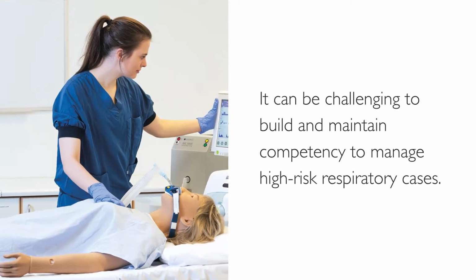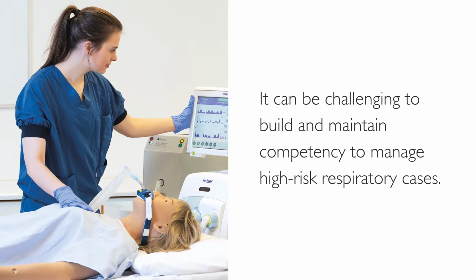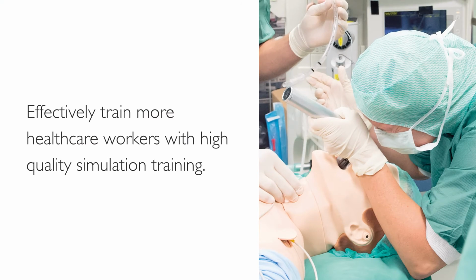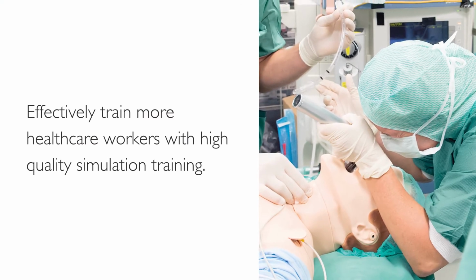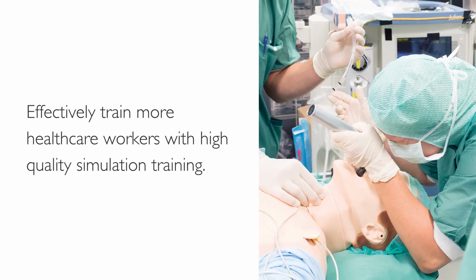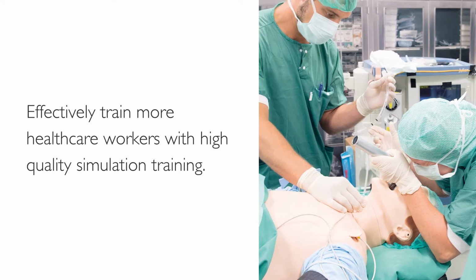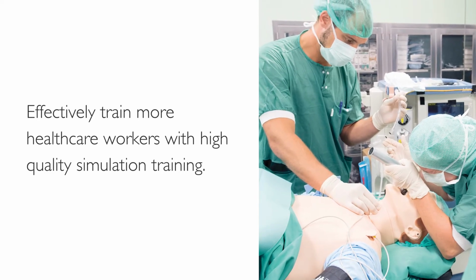Encountering and managing certain high-risk respiratory cases may not happen very often, if at all, making it challenging to build and maintain clinical competence. High-risk events like those caused by the COVID-19 pandemic can create a sudden need for increased respiratory care training. But how can organizations quickly deliver effective training to healthcare providers so they can safely and confidently care for patients on a ventilator?